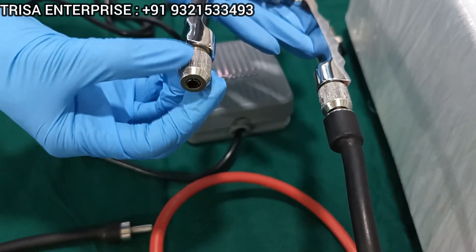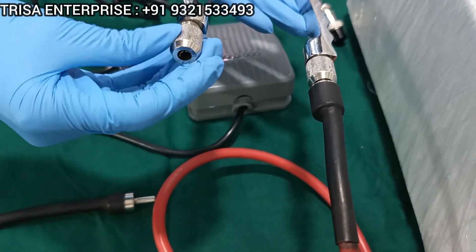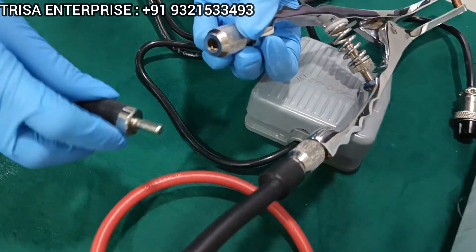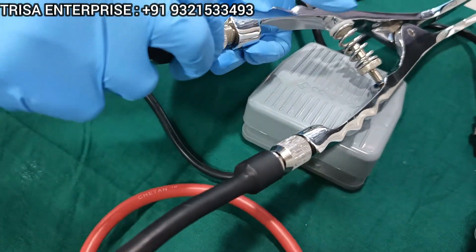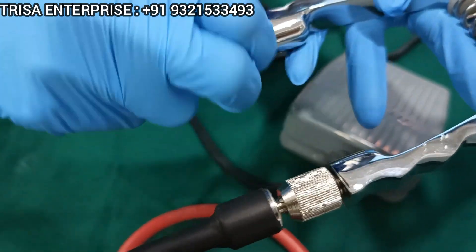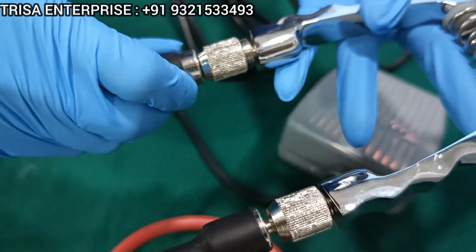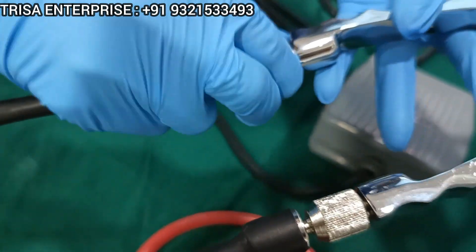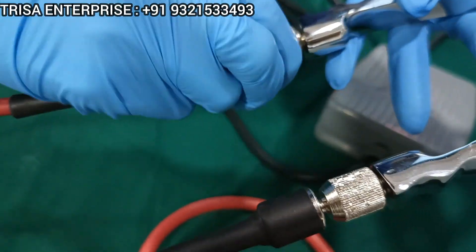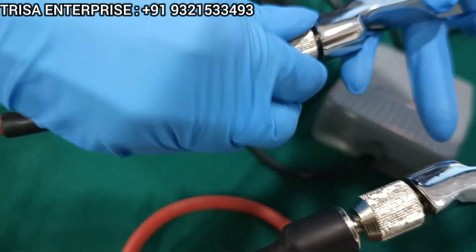My colleague is demonstrating how exactly you can connect the wire with the plier. You need to unscrew the plier a bit, place the jack of the wire inside, and then screw it back. When you screw it back, make sure that all the threads are completely secured and tight, socket nicely flushed with the plier.